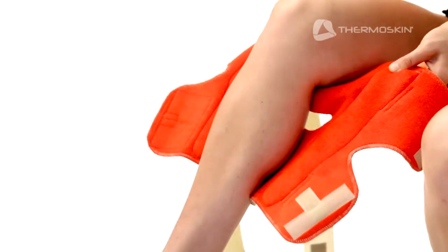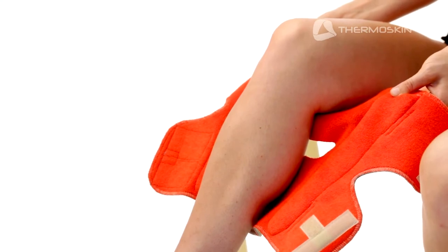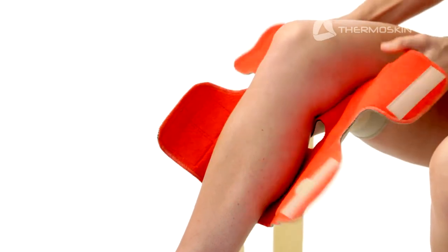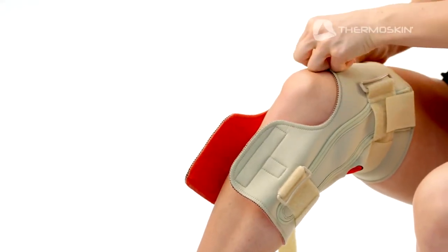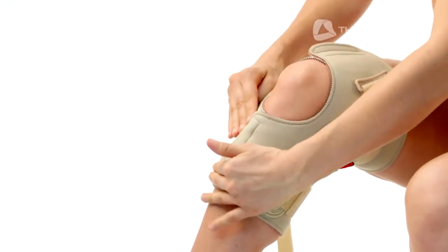Position the brace with the red inner layer and the patella hole against the back of your leg. Make sure the fastener of the side hinge pockets is on the top. Wrap the short top straps over each other and secure the fastener above your kneecap. Wrap the short bottom straps over each other and secure the fastener below your kneecap.